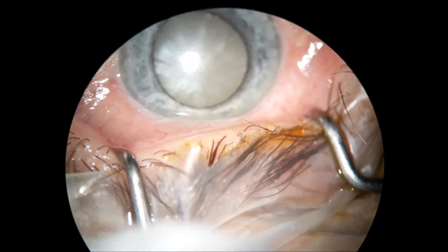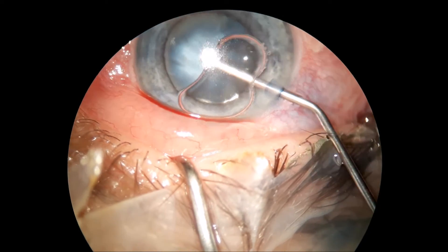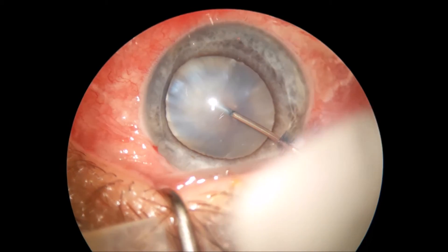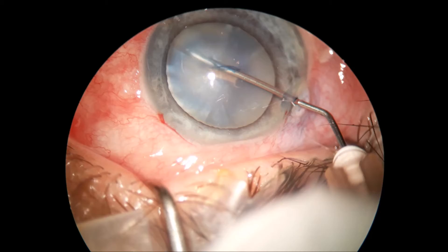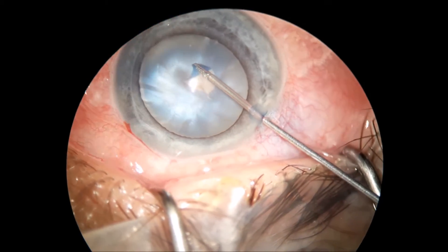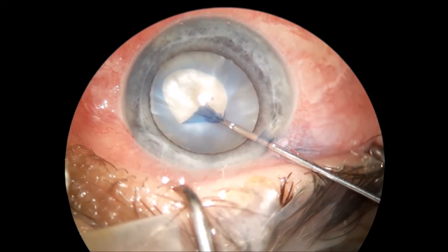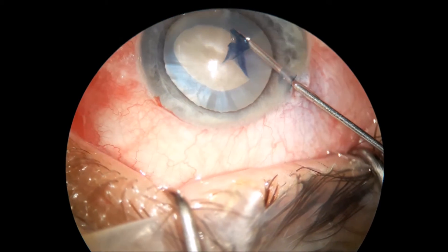I am trying to put the OVD here, fill out the anterior chamber with viscoelastic, and trying to pressurize that anterior capsule a little bit in order to perform the capsulorhexis without having an Argentinian flag sign. Here the rhexis is trying to run towards the periphery a little bit, but I am able to bring it back to the center and end up with a continuous capsulorhexis.